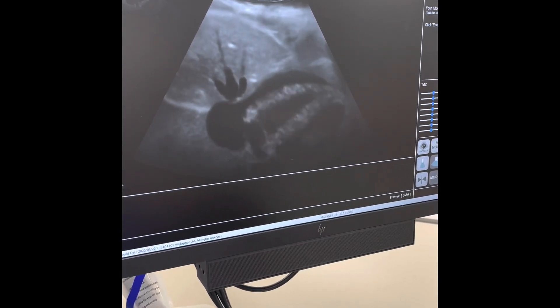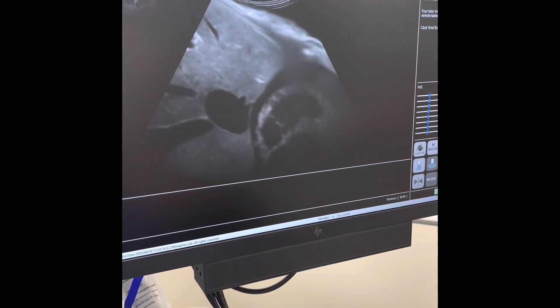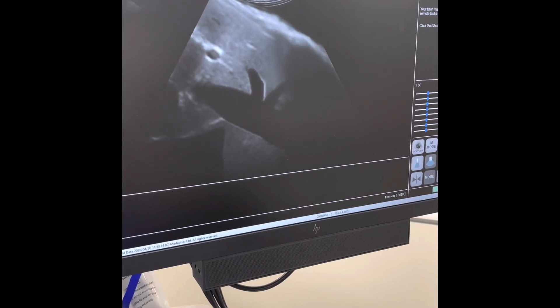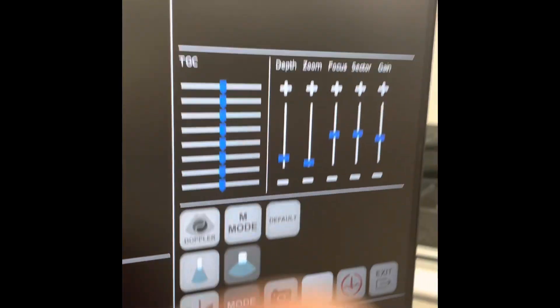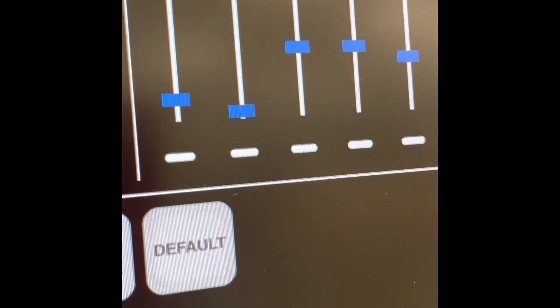Right ventricular collapsing. And then when I do the IVC, you would see that it is not mobile and it is very dilated. Because this is a trauma patient that I have made, there is no lung sliding. And when I go ahead and do the M-mode, I will see that Maya has a stratosphere sign on the left side confirming pneumothorax.